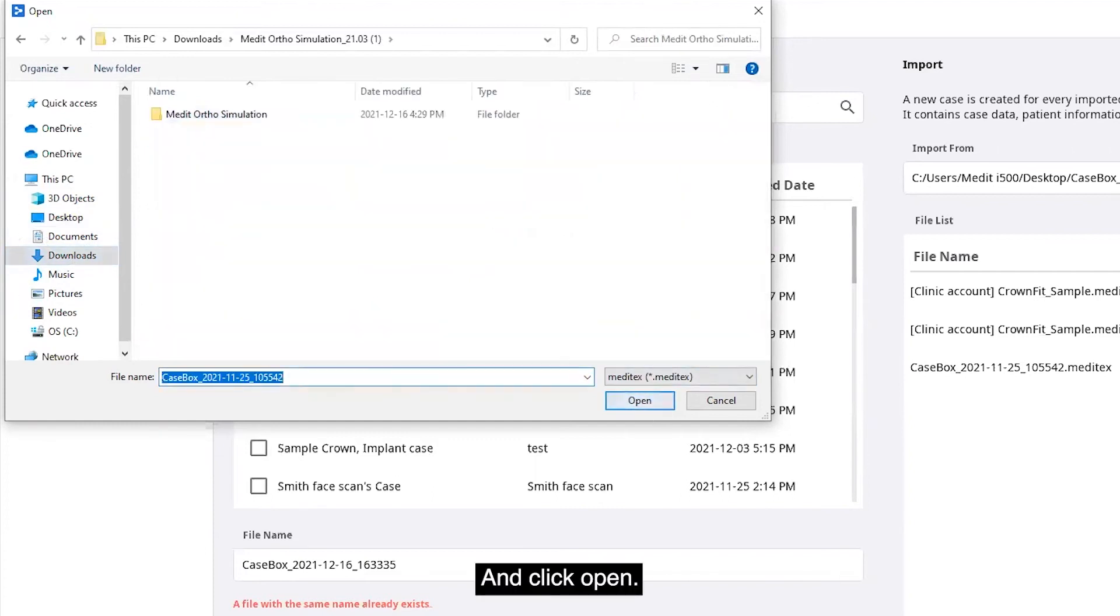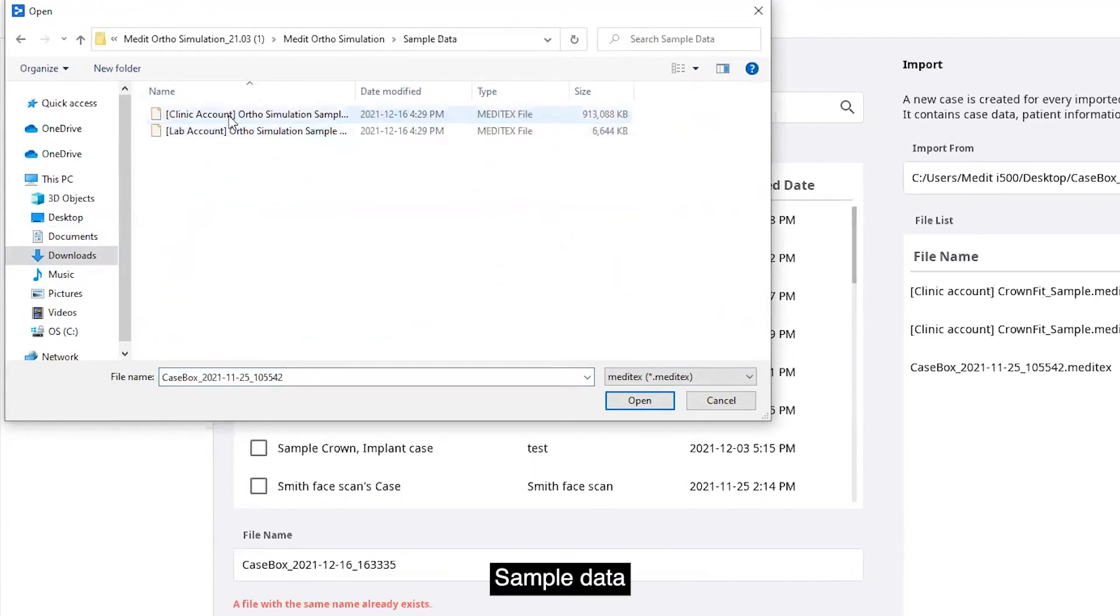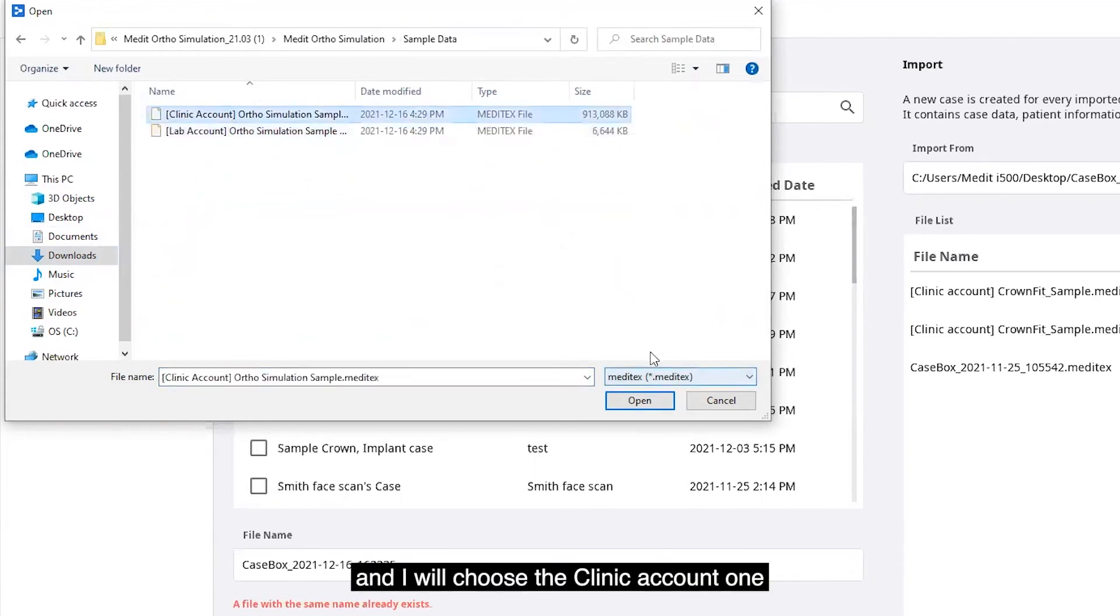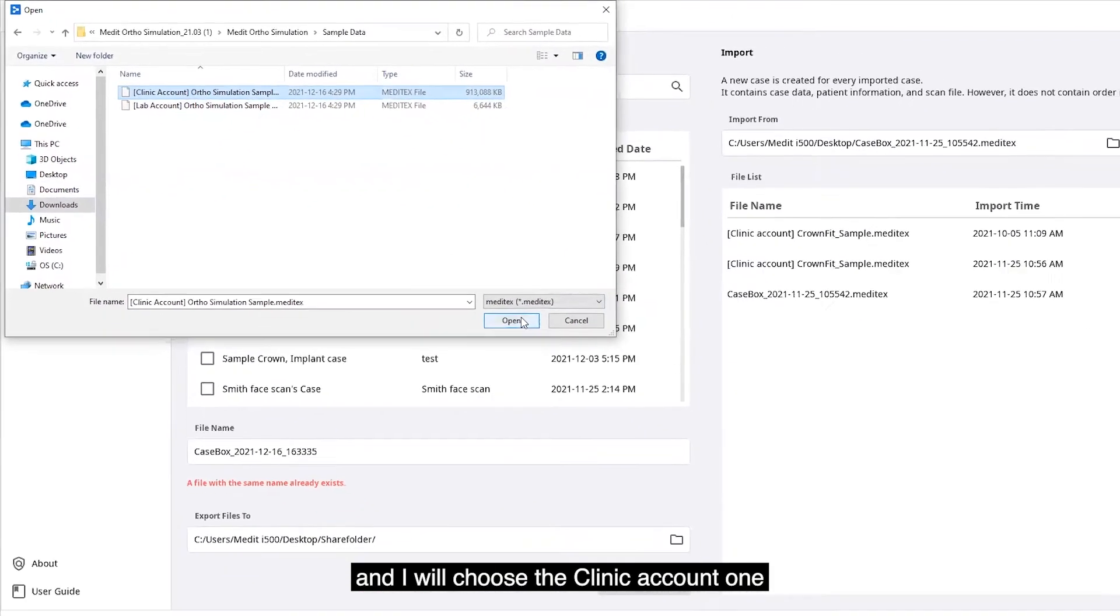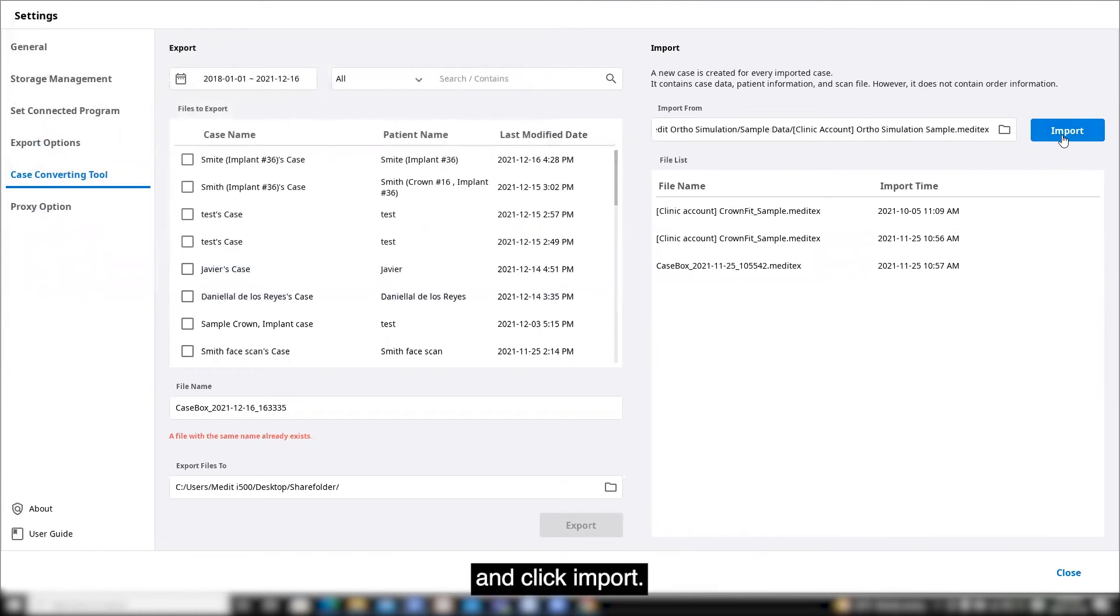Click open. I'll choose the clinic account one and click import.